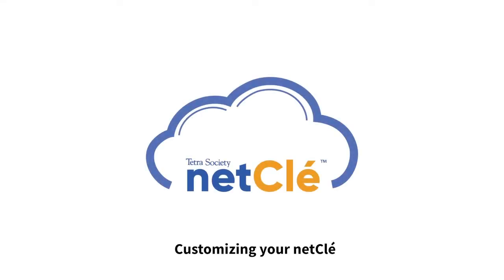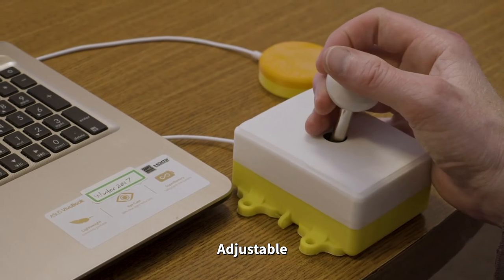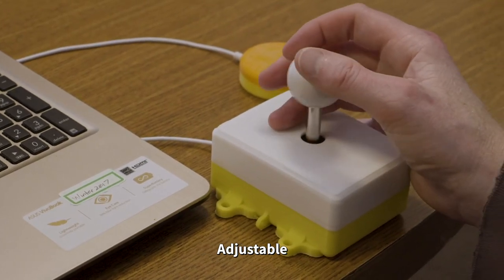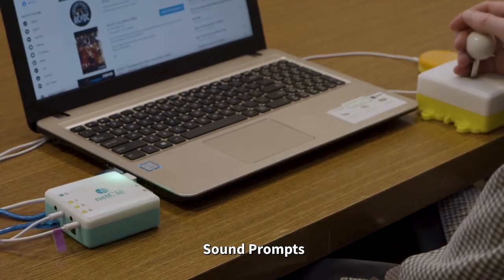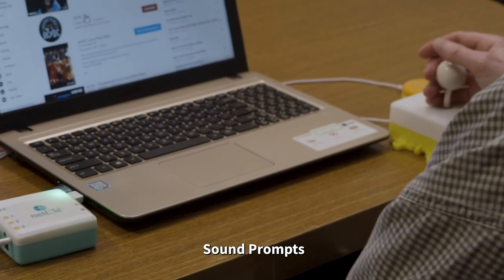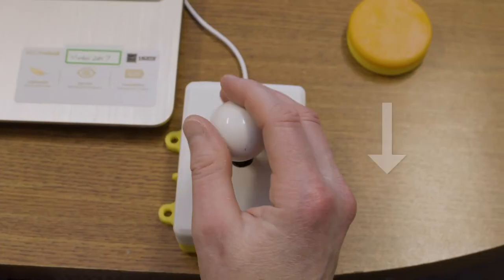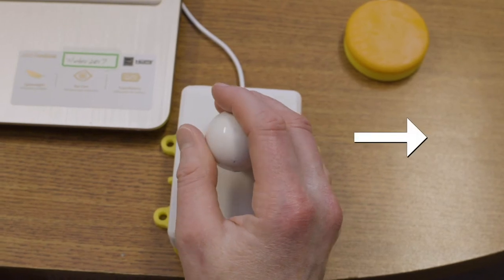NetClay is a very customizable solution, and the input peripherals can be fine-tuned to meet individual users' needs. For a joystick, the tap speed can be adjusted to user preferences. A joystick can be configured to be a mouse with left and right clicks. When the joystick is set up as a mouse and NetClay gives a low beep, performing a quick tap down and release is a left click, and a quick tap right and release is a right click.